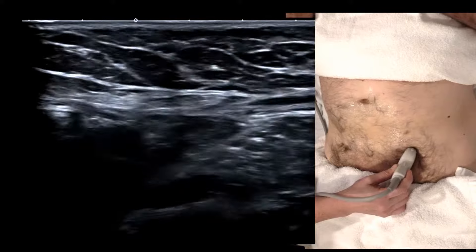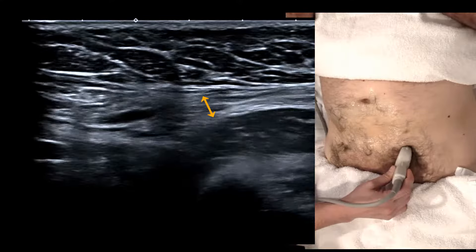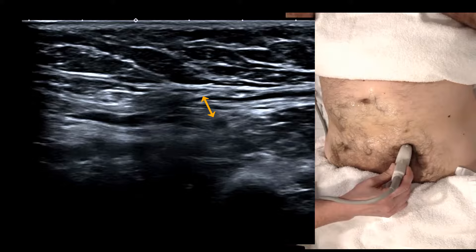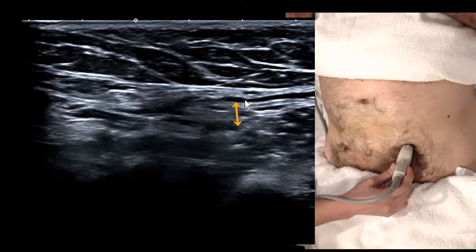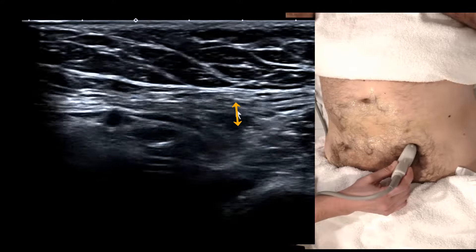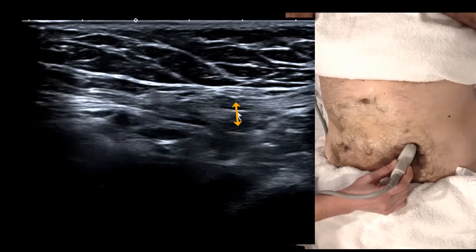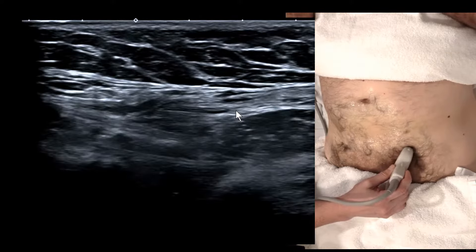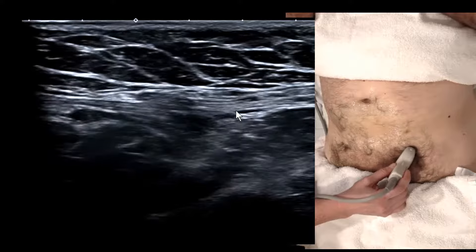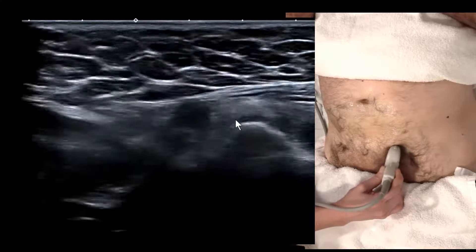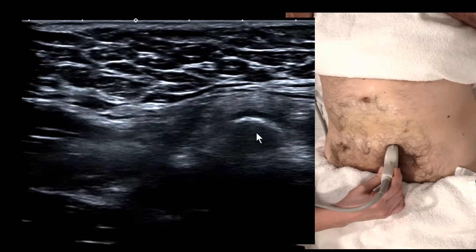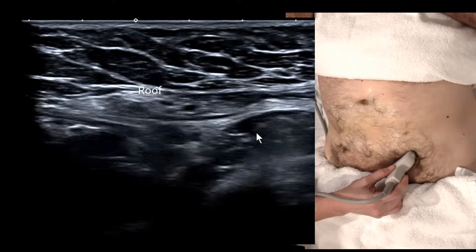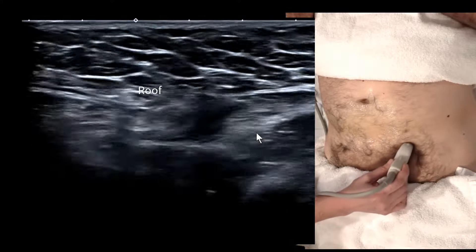Nine times out of ten the spermatic cord gets displaced laterally, so if you can't find it, move more lateral. Find the veins and let your eye fall onto them, then start tracking them supralaterally. The line your transducer is on runs from pubic tubercle to ASIS — you can't go wrong. Draw that line visually from the pubic tubercle to the ASIS and start following those veins up.